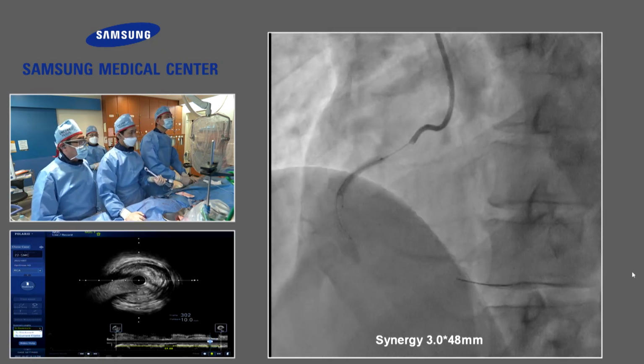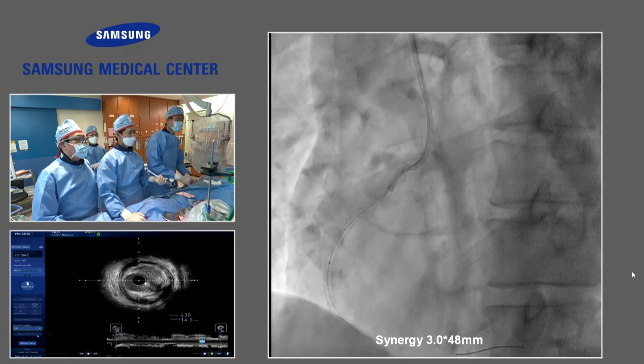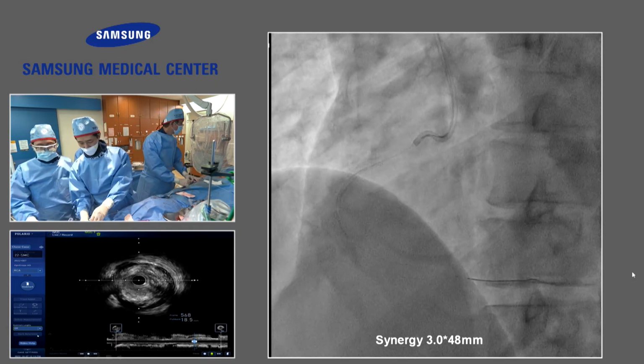Just less than 20 seconds? Yeah. Of course, he planned to do post-ballooning. It definitely did not reach.